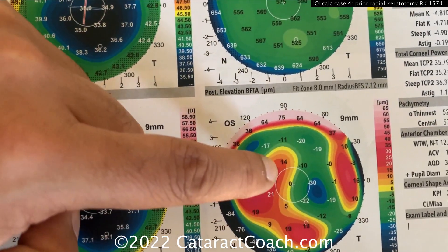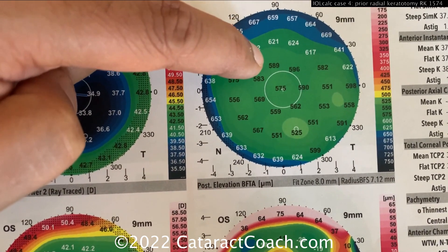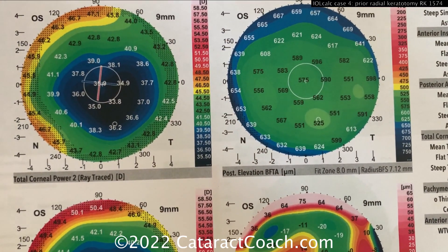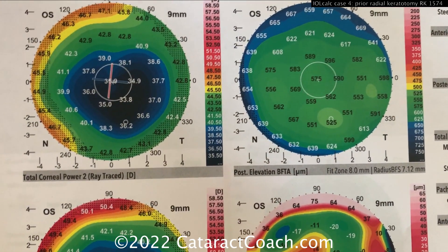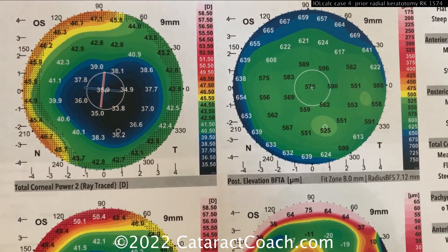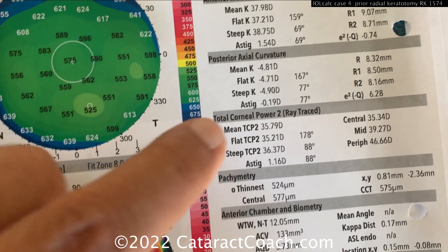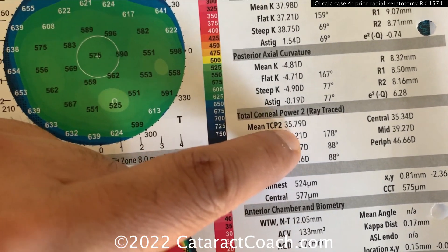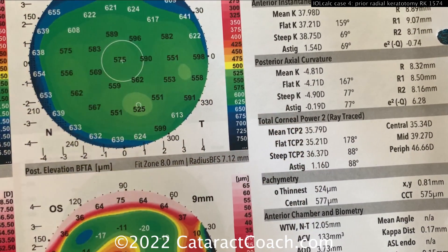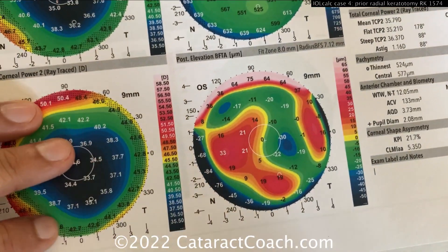There's the effect on the posterior elevation, and here's the thickness. The pachymetry is normal because RK is not taking away corneal thickness — it's just changing corneal curvature. The ray trace gives an average mean power in the center of about 35.79, so that's another good data point.